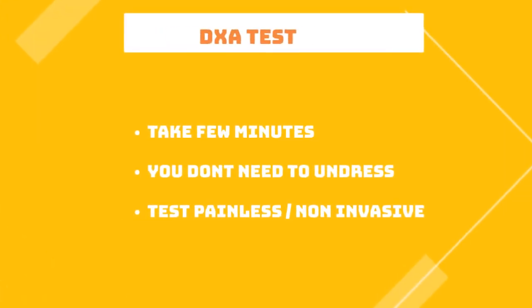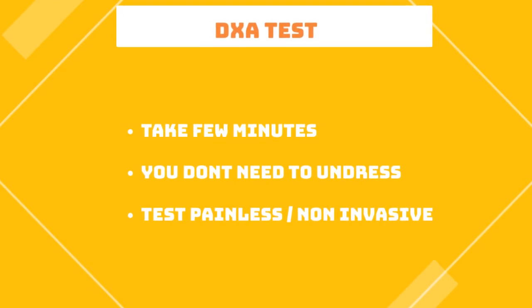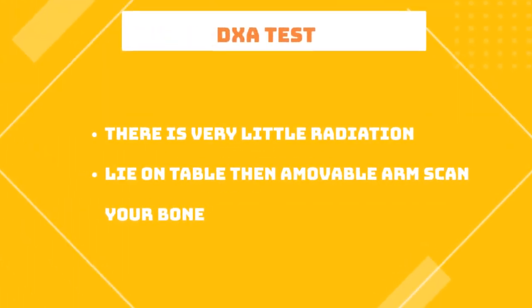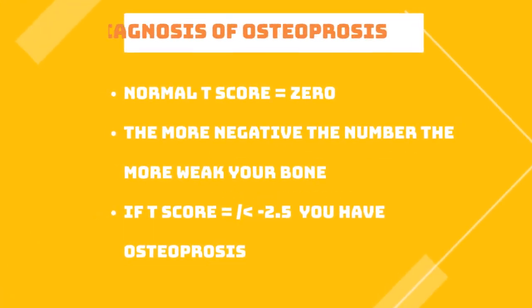The test takes a few minutes. You don't need to undress, but you must not have buttons or zippers in the area of the spine and the hip. It's not invasive and not painful. No needles will be inserted in your skin. There is very little radiation. The technician will ask you to lie on the DEXA table, where a scan arm will move over your body and scan your bone.